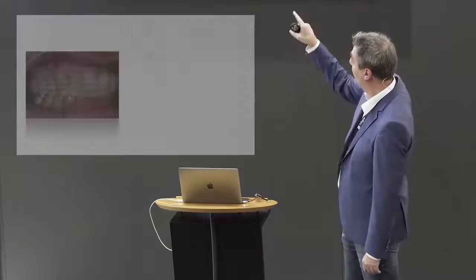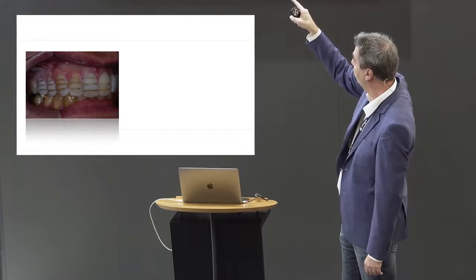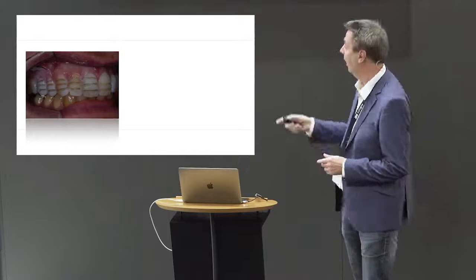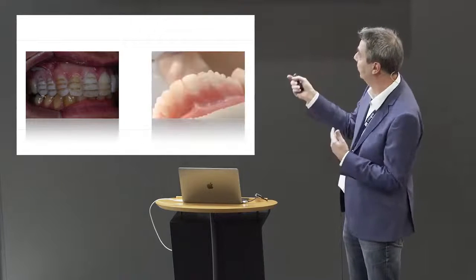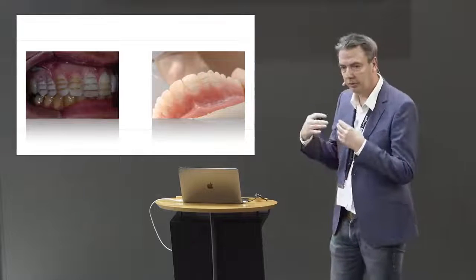I was always telling everybody, please use a depth cutter with just 1 ring on it. Because I always try to create 3 depth cuts, 1 incisally, 1 in the middle part of the tooth, and 1 on the cervical part of the tooth. I go all the way from the mesial to the distal, and then I mark everything. The depth cut is into the mock-up.